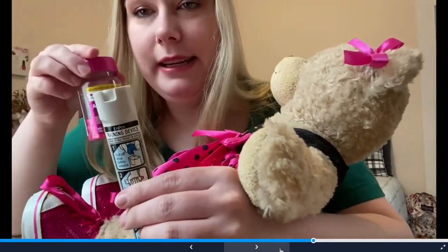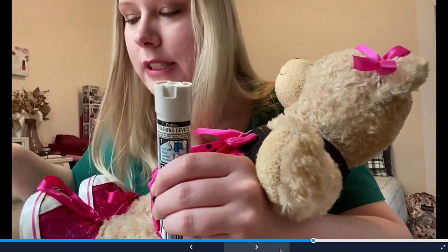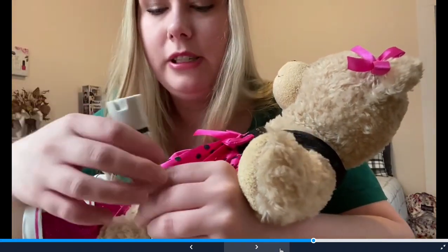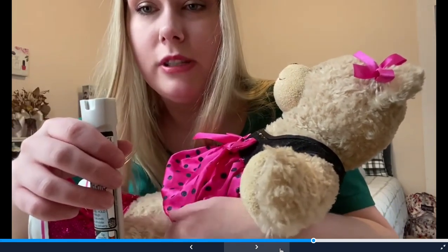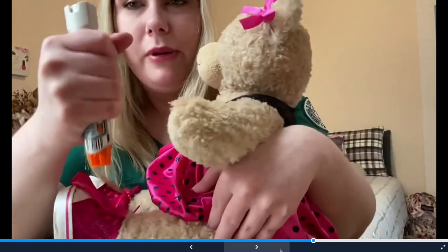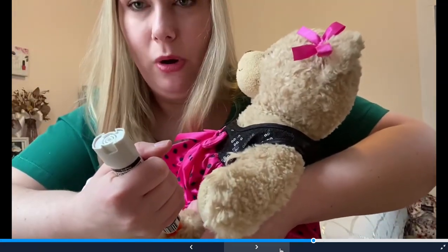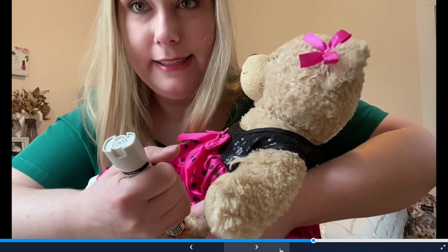The medicine inside the pill that goes inside your mouth that you eat doesn't work as fast sometimes. So in situations like this, it's important that you use the speed lightning medicine, okay? So now that we're holding it in the middle, we're gonna put it in the outside of her thigh. Remember, hold her still and hold her leg steady.